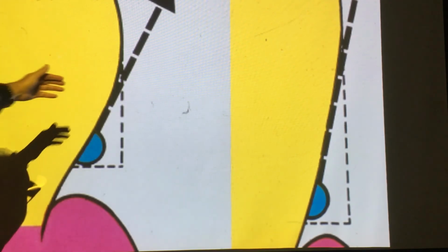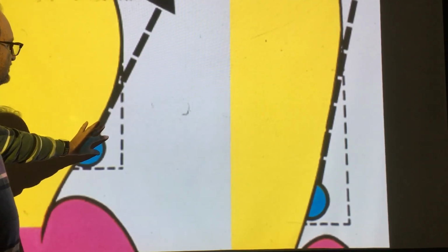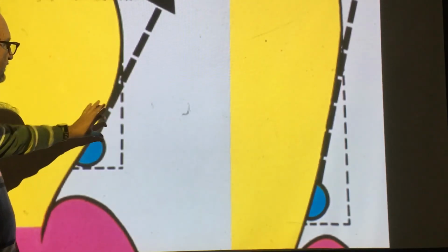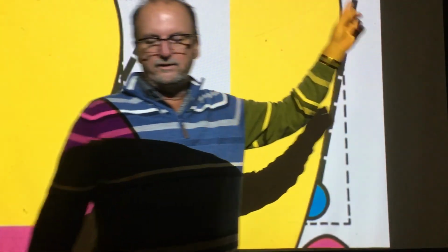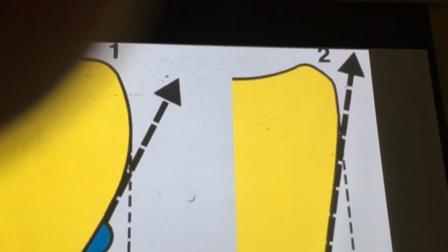So you can see here the height of contour is here. The clasp sits here when it's in situation. Once it comes to dislodge, it goes over the height of contour here. But you see the difference between here and here? It's not that much. Over in the picture on the right, depending on the shape of the abutment tooth, this clasp has to travel a lot longer to get over the height of contour. Not necessarily meaning one's right and one's wrong. I'm just saying the depth of the undercut is not arbitrary. The depth is the depth depending on the shape of the tooth. The shape of the tooth can be changed by the dentist if we choose to. If the dentist chooses to change, maybe you're not getting number 2 up there.